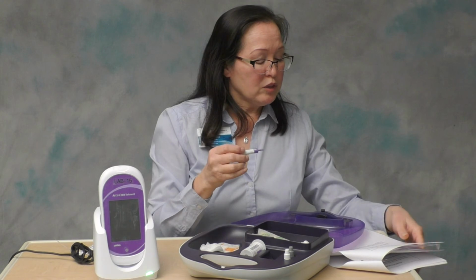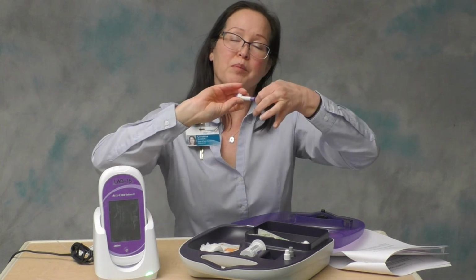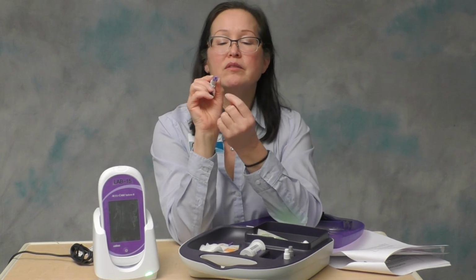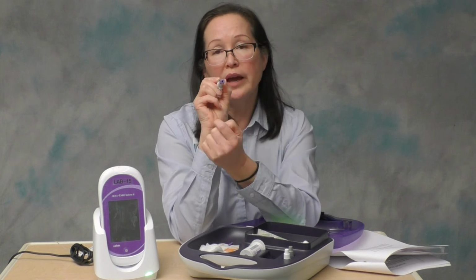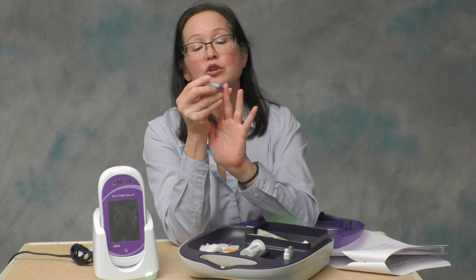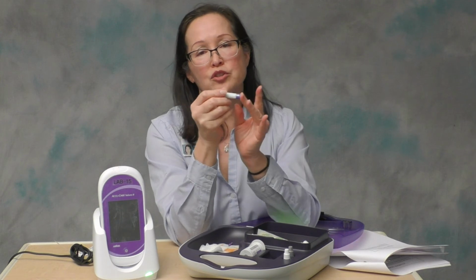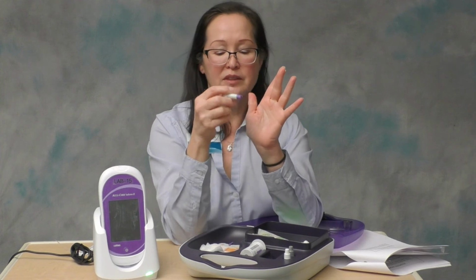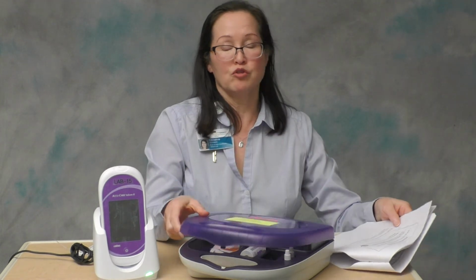And then when you've made your site selection, you've cleaned the skin off, allowed the alcohol to dry, what you're going to do is just twist this purple pin, remove it, it's ready for use. If you look on the end of the shaft, you'll see that it has an oval shape. So you want the longitudinal axis to be perpendicular to the fingerprint lines. And then these are not pressure activated, so you need to activate the trigger with your thumb. That will activate the lance. Wipe the first drop of blood away, and then you can use the second and subsequent drops for your specimen.